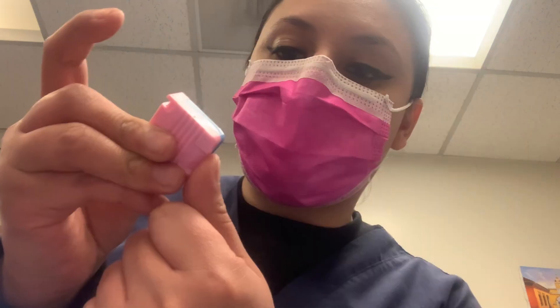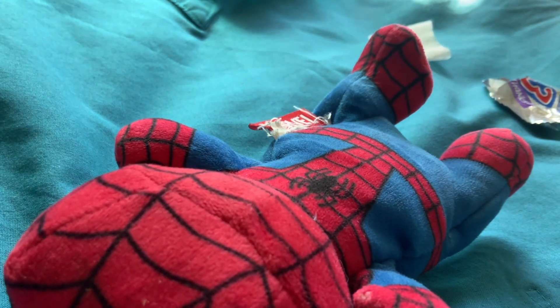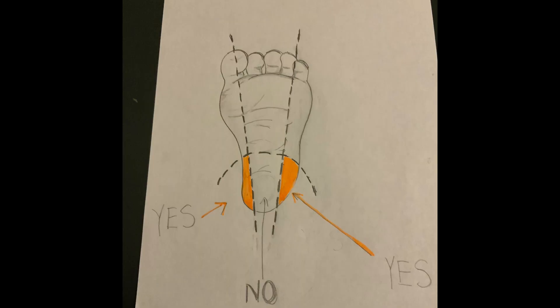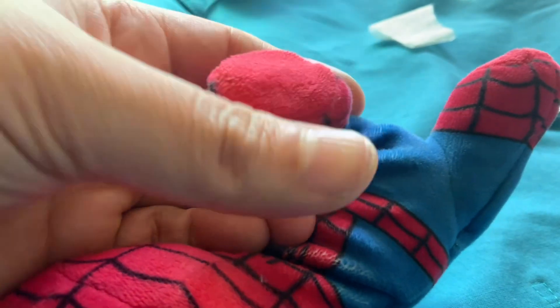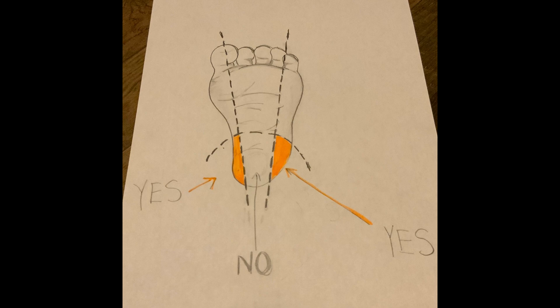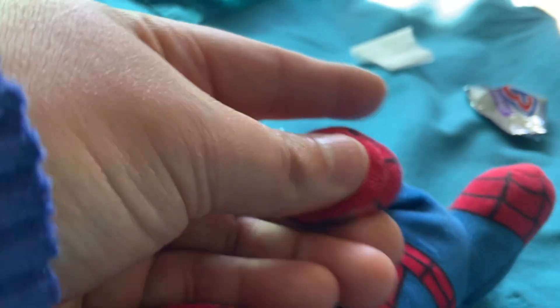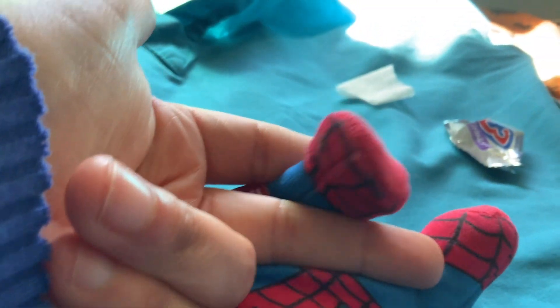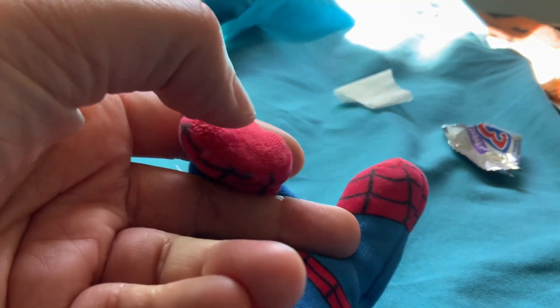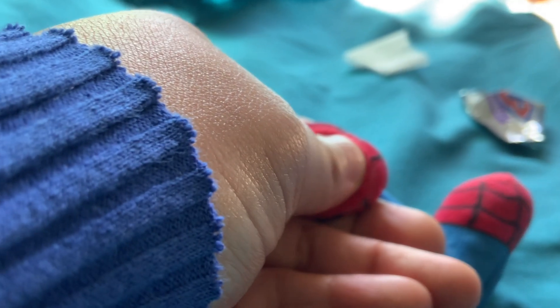You remove the cap — this is where you're going to poke. Just pretend this is the heel. Babies have an area on the heel where you're not supposed to poke. Here's the best trick: put your thumb exactly there — where your thumb is, is where you're not supposed to poke. I never remove my thumb from there and I hold the foot like this.